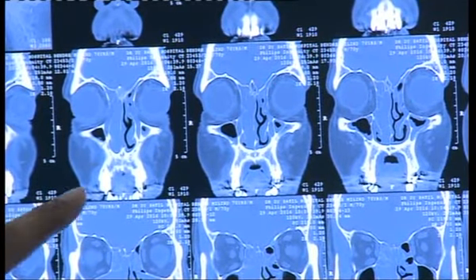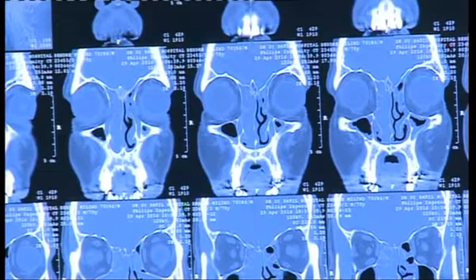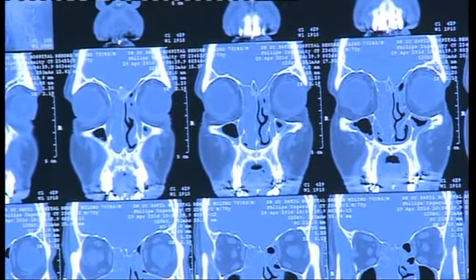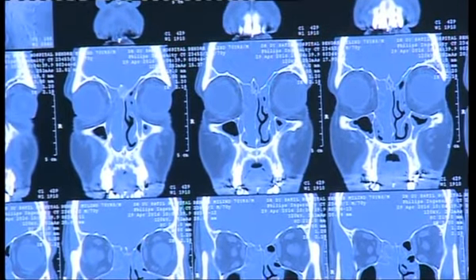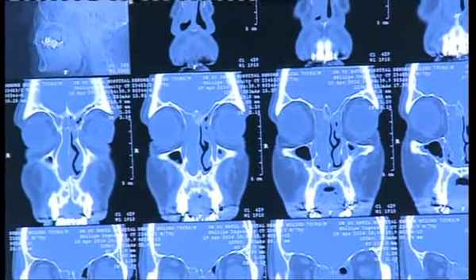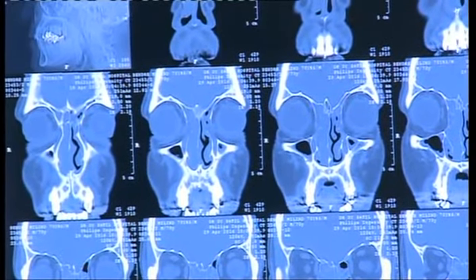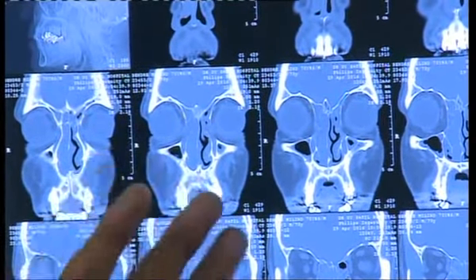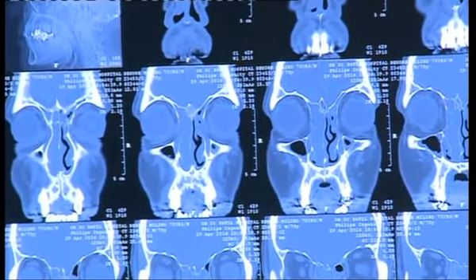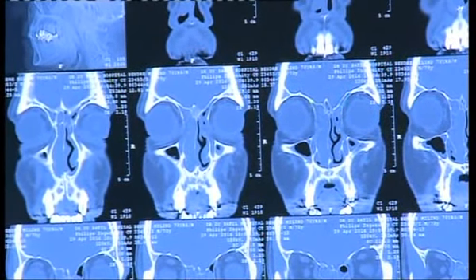Sorry to ask a question. Is the supraorbital cell associated with the anteroethmoidal artery? Yes, it has a relationship, not associated. You can infer the location of the anteroethmoidal artery. The reason being, the more supraorbital pneumatized, you'll find a good big cell, and then you can assume the anteroethmoidal artery is going to be immediately caudal to it.